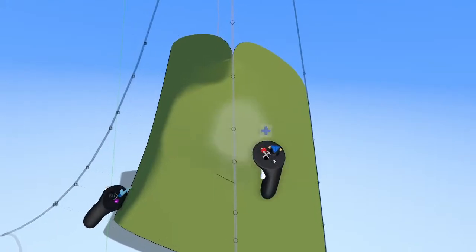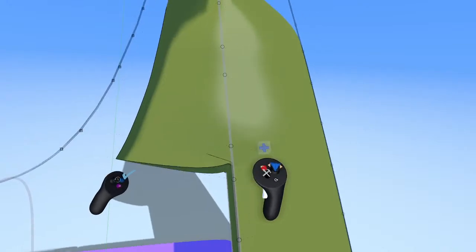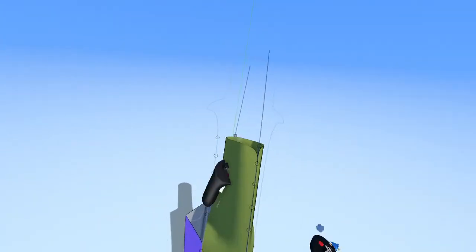And what you're going to see is as we're going through and connecting these together, the shape is starting to blend itself together. Just like that. We get a nice smooth transition here.